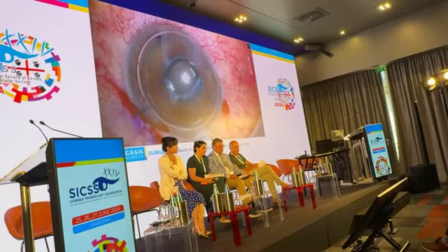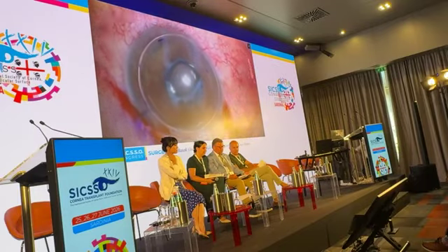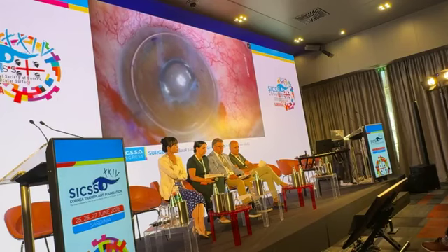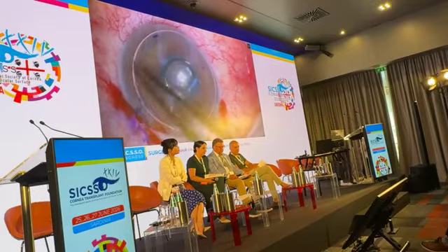The idea of putting air, after I always dissect the recipient first, is to put the air after washing the Healon. Then you need to see the edges of the DM, what you have done, the Descemetorhexis. So you can see very well the edge. These marks are actually the 8.5 millimeter mark. These are template marks, so my Descemetorhexis size is 8.5 or a little more.